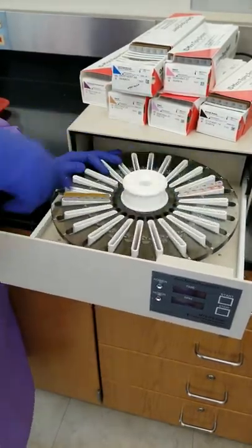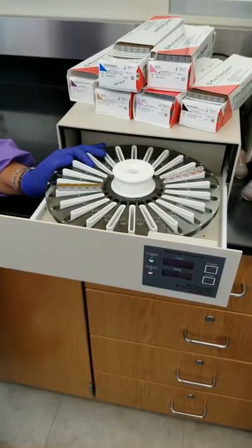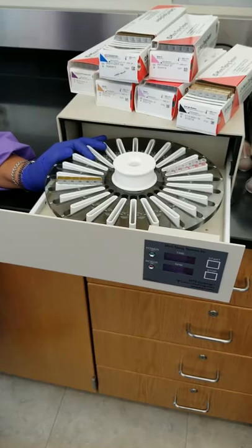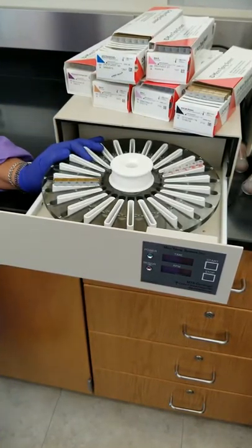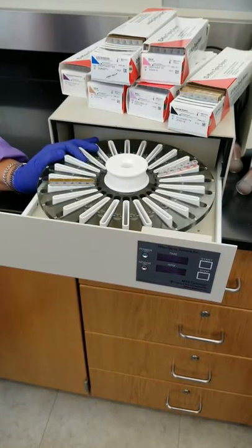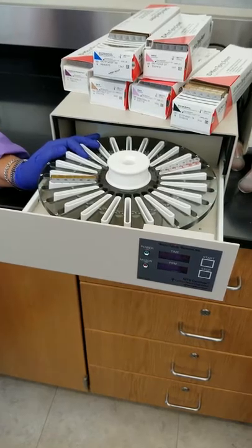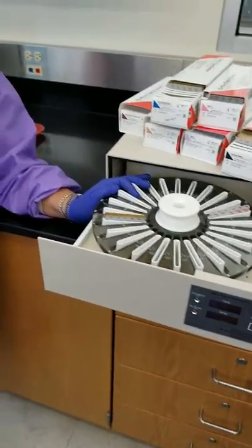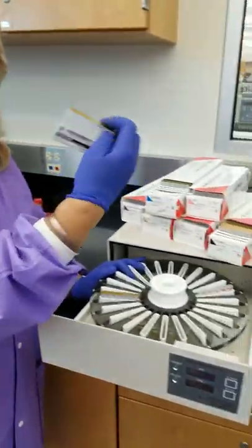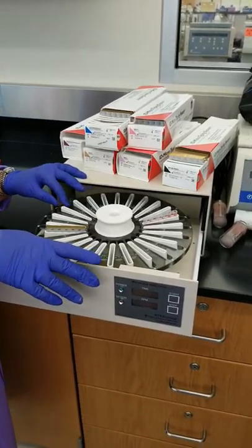So as long as you don't have anything in them, you could spin these cards as many times as you really want. There's nothing that's going to hurt them. In fact, the company came in one time and told us if for some reason you laid them on the counter like that or like that, now they're such a small volume, the liquid will run up into the foil and then they won't work very well. Eventually they'll dry out, but the company had told us that you could just stick them in the centrifuge and spin them, and as long as they looked in the pristine condition that they should look, then you can go ahead and use them. Although then they came back later and said, oh no, we really didn't officially say that. But I think somebody must have had problems with it, and then here they go back and say, oh well, we were told you could do that.